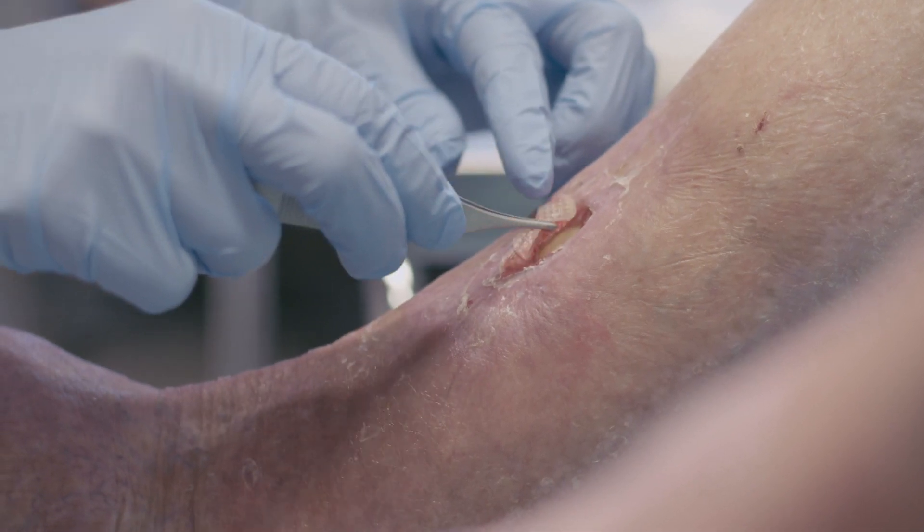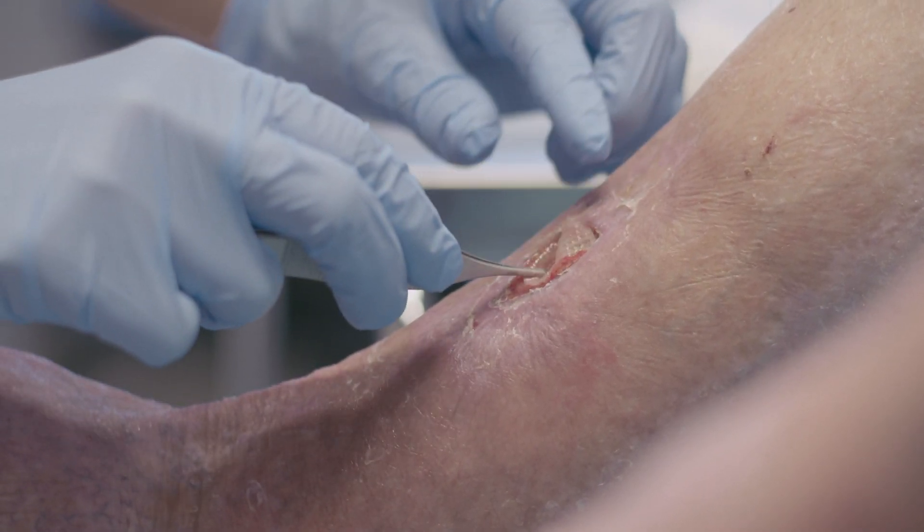The major benefits with the 3C patch system is that it is healing more hard-to-heal ulcers than usual treatment — we know that. And that means that we will reduce costs in the healthcare system. We will improve quality of life for our patients, and on the broader scene, we will avoid amputations.